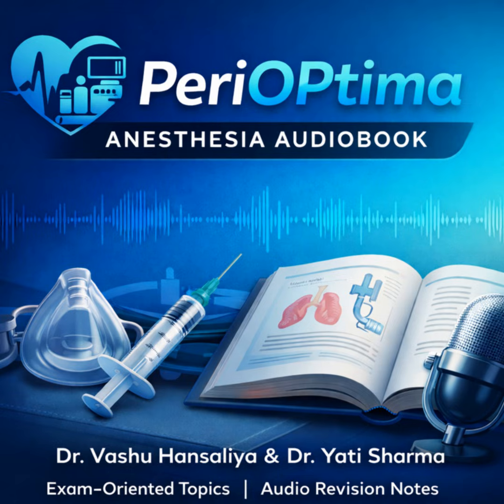Let's detail the necessary electronic alarms then. Beyond the supply alarms we already talked about, we mandate oxygen failure alarms, that auditory warning of supply pressure loss. Then, pressure alarms, which detect both high and low pressure. Right. High pressure, signaling potential barotrauma or an obstruction, and dangerously low pressure, which signals a disconnection or a leak. And then the vital oxygen analyzer alarms, warning if the measured FiO2 falls below that safe preset threshold.